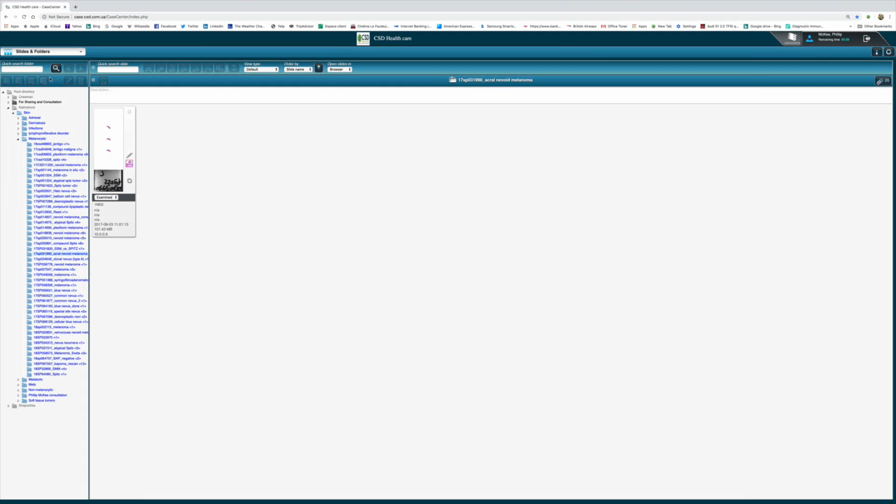In this short video, I'm going to demonstrate a nice example of small cell melanoma, which was very kindly shared with me by Antonina Kalmykova of CSD Health Care in Kyiv.